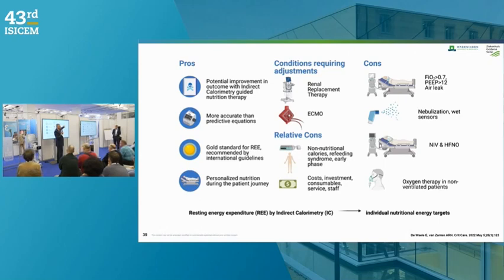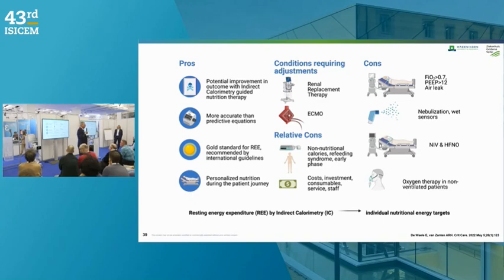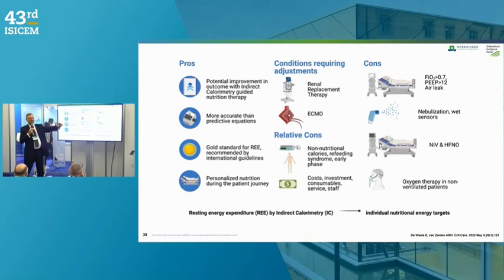And when you lose air, so what about the chest drain when you remove fluids from the chest? Can we use indirect calorimetry then? No? Everybody agree we cannot use? If it's fluids, there's no problem. When there is a fistula and you have leakage of air, then you have a problem. So all the air should go through the endotracheal tube.